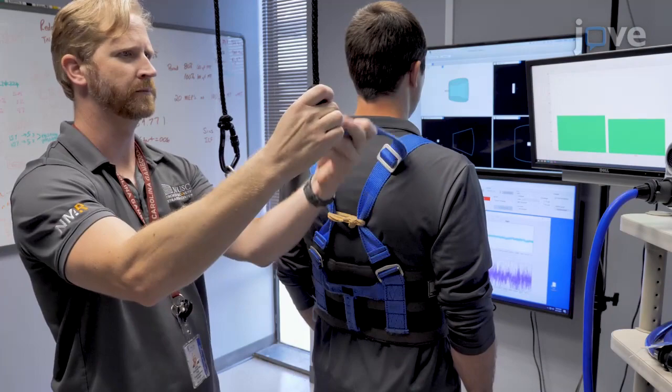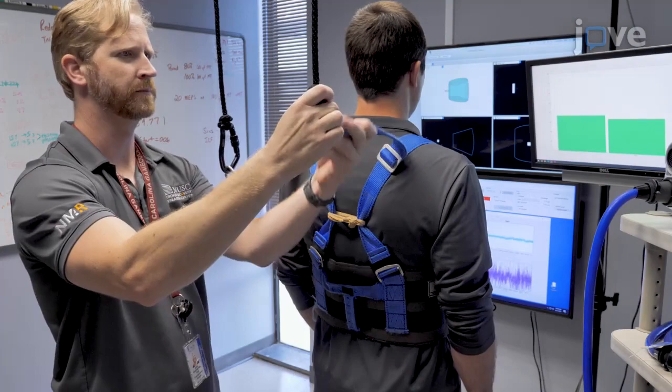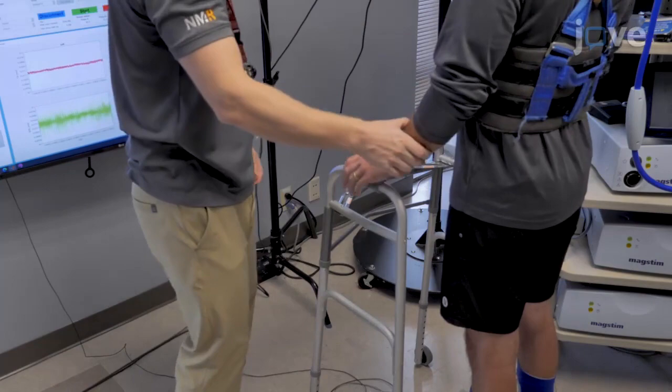Attach the participant's safety harness to the ceiling support. Place a rollator or similar device around the force plate to provide participants with something to steady themselves with during testing if needed. Measure and collect the participant's weight as they stand on the floor.